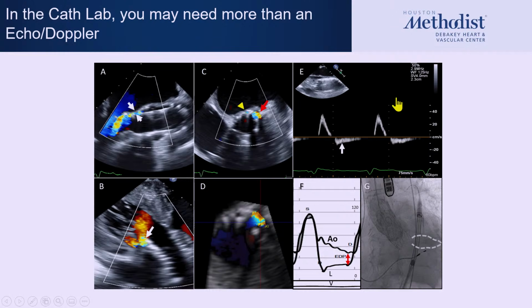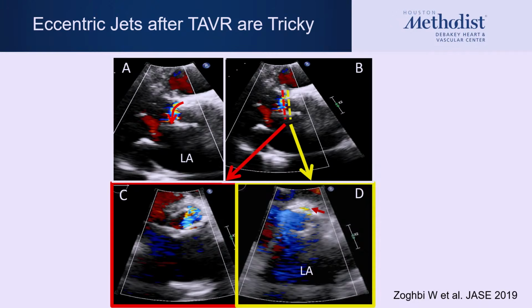After implanting such a valve, in the catheterization laboratory, you probably would need more than just color Doppler unless it's very obvious. People use hemodynamics, use angiography at times to take a look at aortic regurgitation and the severity, and put all these together to decide whether to do further interventions on such a valve. After the patient is out from the catheterization laboratory, imaging such a remnant regurgitation or new onset regurgitation may be difficult. And remember that these valves are rather long.